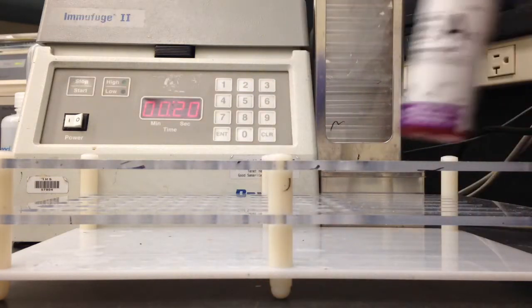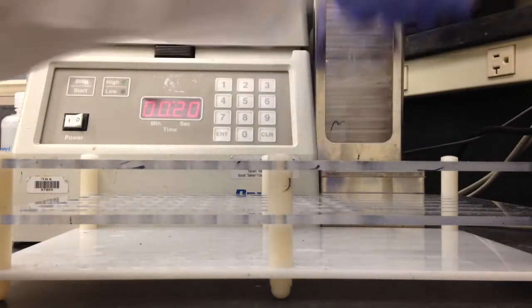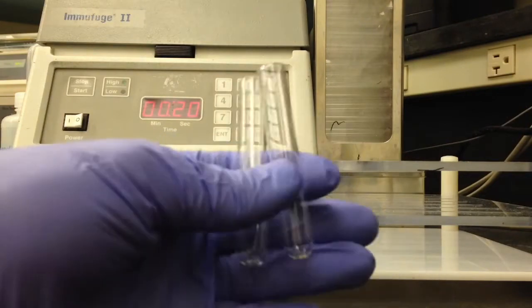You're going to need A2 cells for your negative control and A1 cells for positive control. Normally you'd be testing a specimen as well, but I don't have one so I'm just going to be doing the controls.